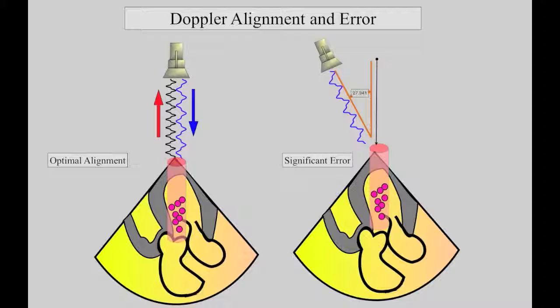So this session will be regarding the aortic valve and the considerations in assessment of aortic insufficiency and aortic stenosis. We're going to begin the session by focusing on a few issues in hemodynamics. One of the calculation considerations is alignment of the Doppler beam with the flow of blood.